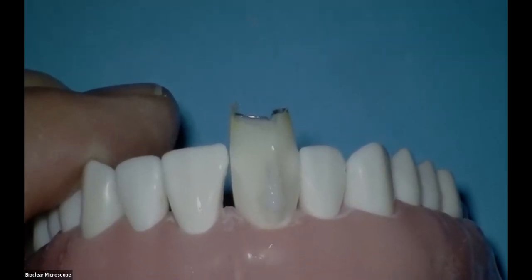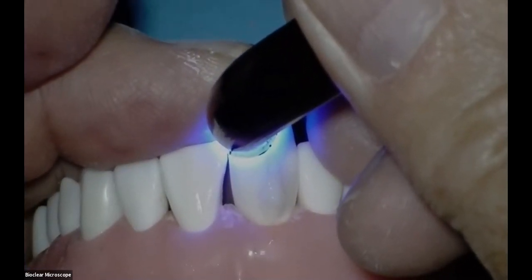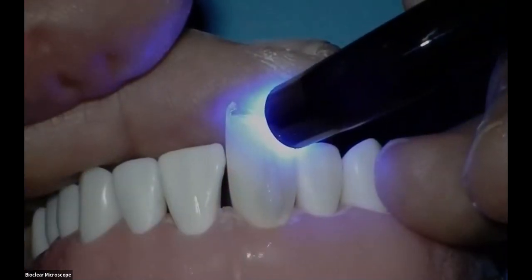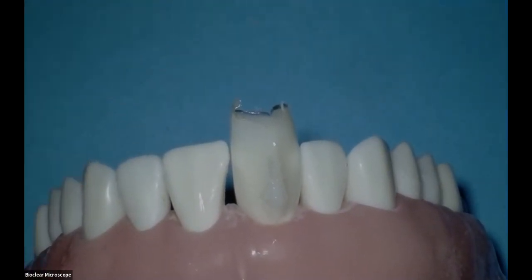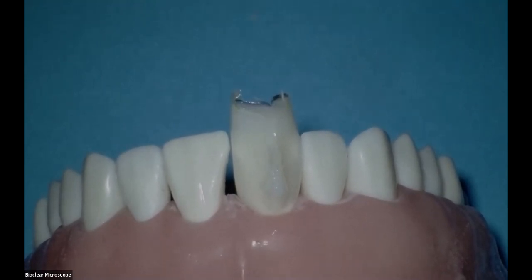So did Dr. Clark change the emergence profile subgingivally? Yes, he did. That is Dr. Clark, everyday stuff. Yes, Dr. Clark, I have a question right here. I'm Dr. Harsh. It's a beautiful emergence profile. Since we discussed building an emergence profile subgingivally, how do you isolate subgingivally because there is sulcular fluid? So how do we get a proper isolation subgingivally so that sulcular fluid does not affect the bonding procedures?